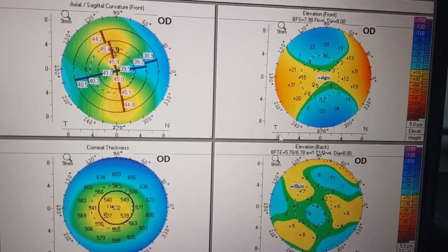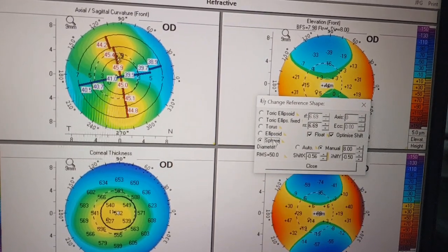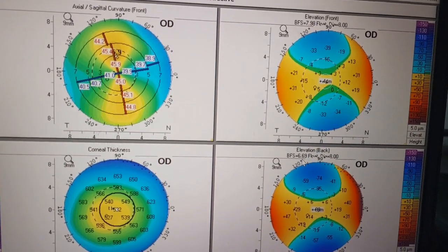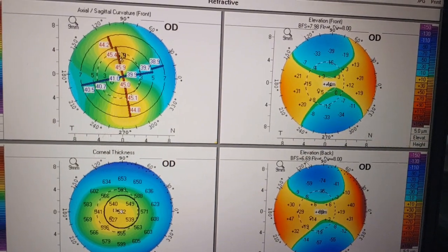Today I'm going to talk about a very important subject that many ophthalmic practitioners don't pay attention to. Simply, when you say that this Pentacam is abnormal, normal or whatever, on what grounds? Based on what do you say that? Simply based on an established reference.